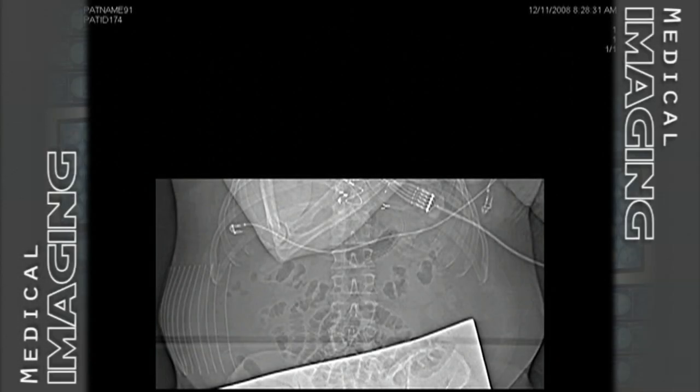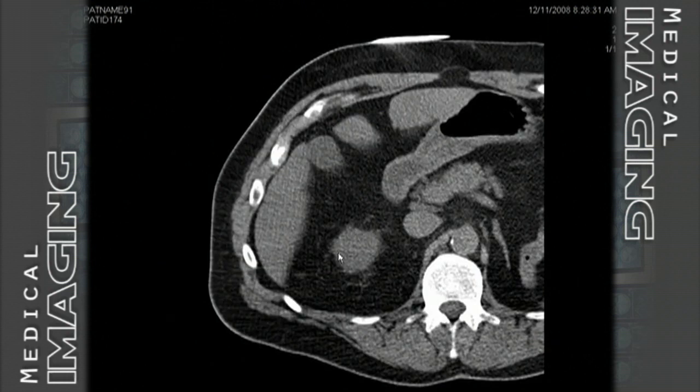This next case is a CT guided procedure of a suspected kidney mass. This patient is positioned supine on the CAT scan table, and as you can see, the surface grid work is in place to localize the areas of interest. Initial slices are taken through the suspected area to localize the area where they're going to introduce the ablation tools.